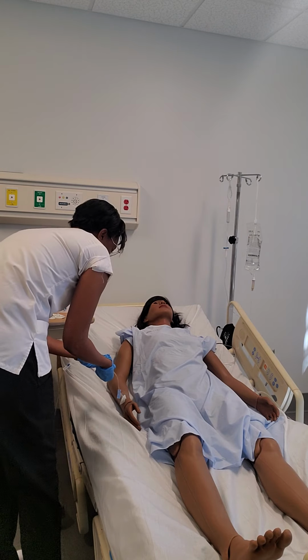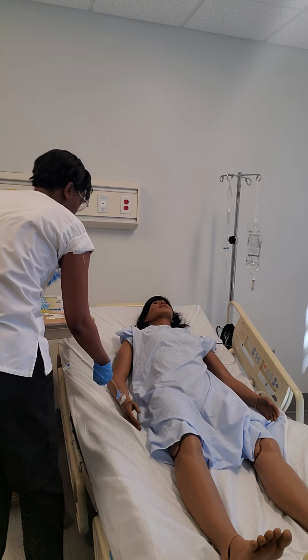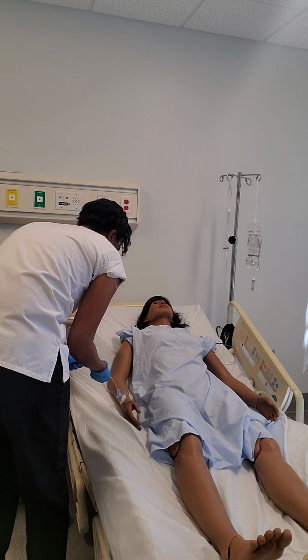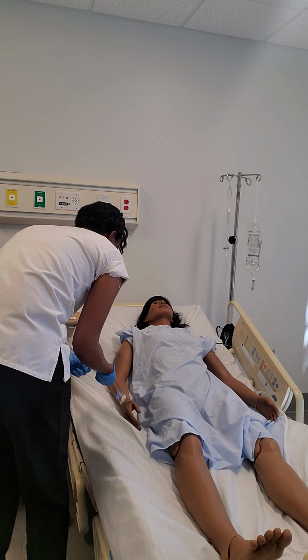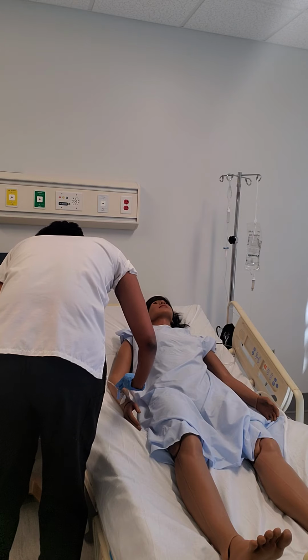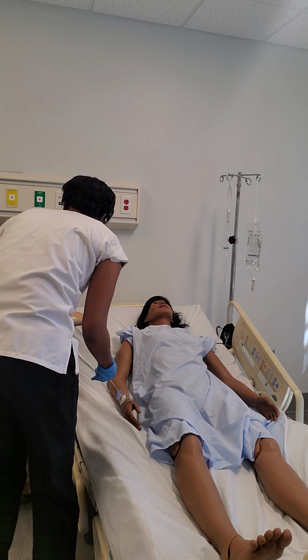So prior to giving that medication, I would unclamp, and I'm going to scrub the hub, and then I would get a new saline flush. We're going to aspirate, make sure that we have blood return, and we do. So then I would push 3 to 5 milliliters of the saline in, and I'm also making sure that the patient isn't experiencing any pain or discomfort and that I don't see any edema. So that's done. We throw that in the trash can.